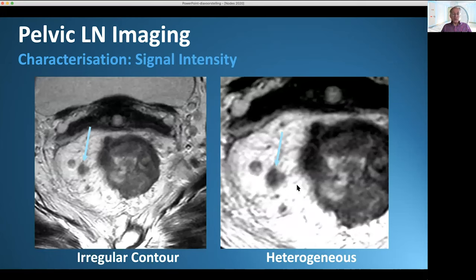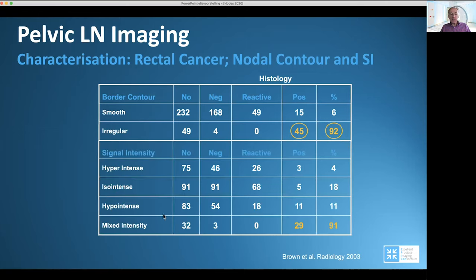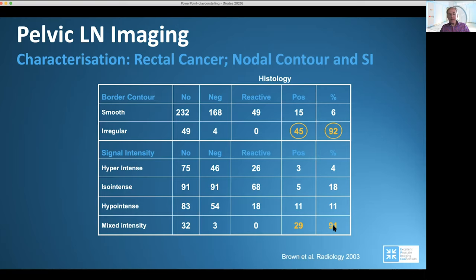Signal intensity is also important. If the signal intensity is inhomogeneous, the chance of metastasis is higher. A smooth lymph node is positive in only 6%; an irregular lymph node goes up to 92%. The same applies for mixed signal intensity and inhomogeneity — the chance of being metastatic goes from 4% to 91%.